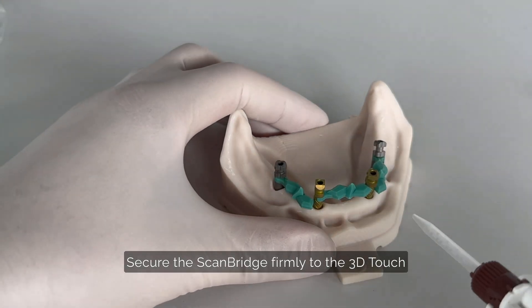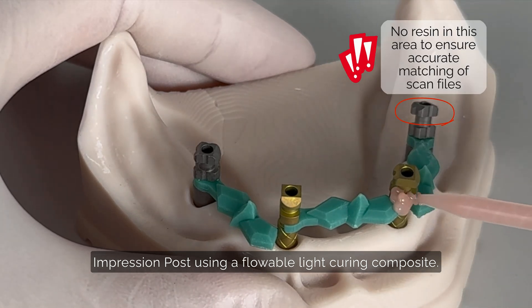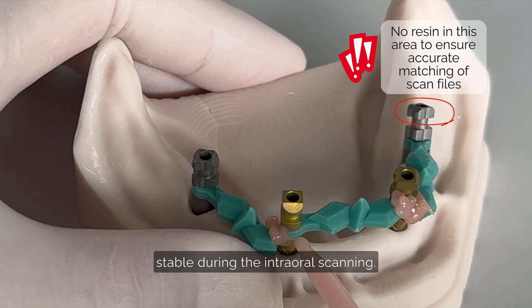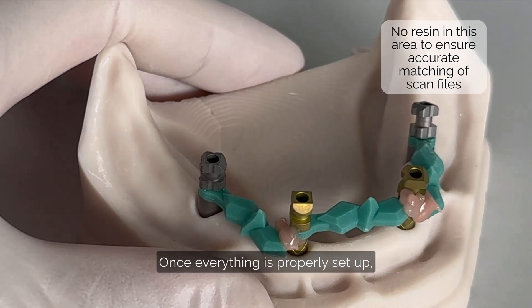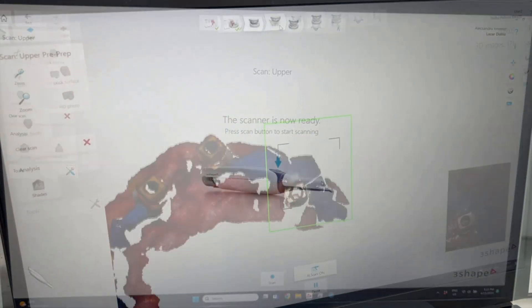Secure the scan bridge firmly to the 3D Touch impression post using a flowable light-curing composite. This ensures the setup remains stable during the intraoral scanning. Once everything is properly set up, you are ready to begin scanning.